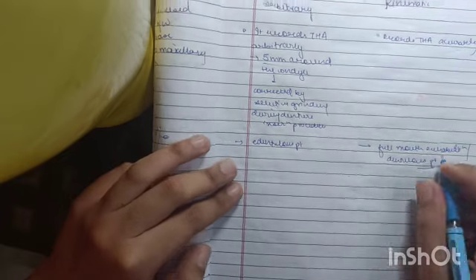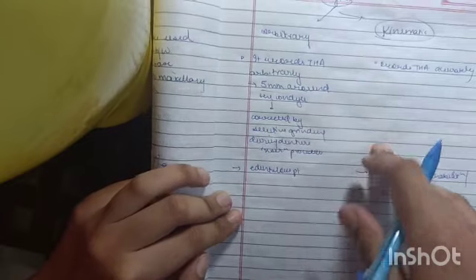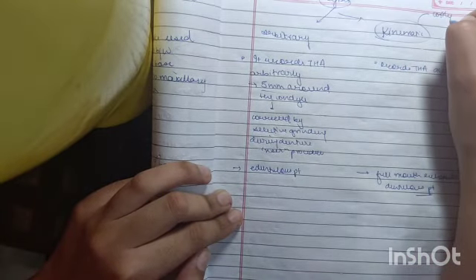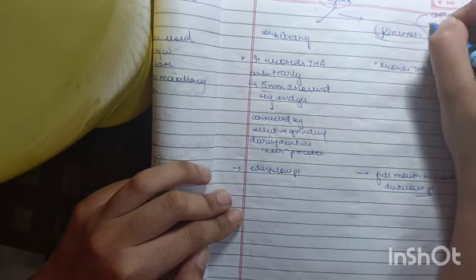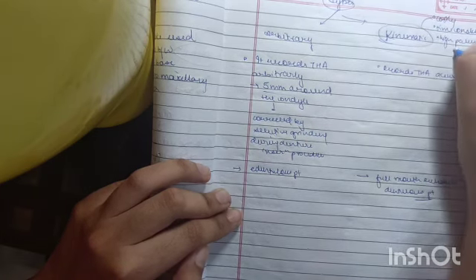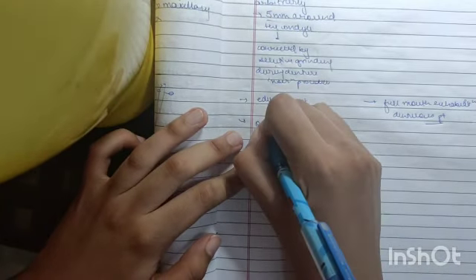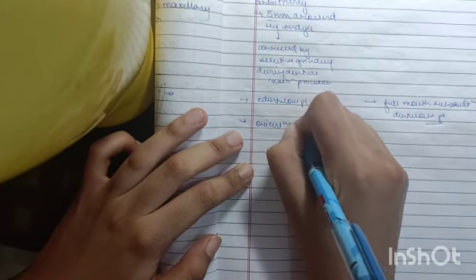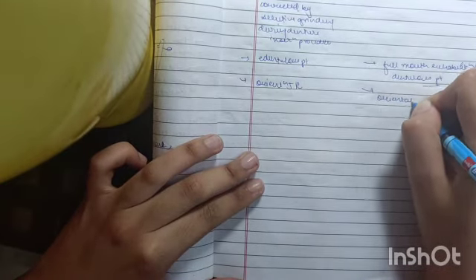Now, a question arises: why do we not use kinematic in edentulous patients? Because the procedure is highly costly and time consuming, plus the age of edentulous patients is higher, so high patience is required in the patient, which is usually absent. So, in arbitrary we can only record the orientation jaw relation by the face bow transfer, whereas in kinematic, we can record orientation as well as the centric relation.